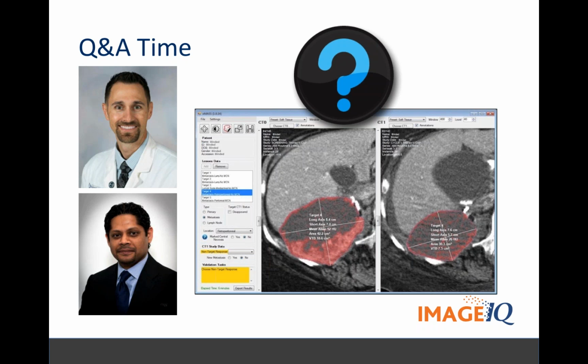It's just not been an accepted form of analysis for the FDA. And if you're using software to do 3D, you don't want to have to draw splines around every single slice to characterize a tumor. That would be opposite of the time thing. The 14 minutes would go up to 140. Correct. Just for 1 week.